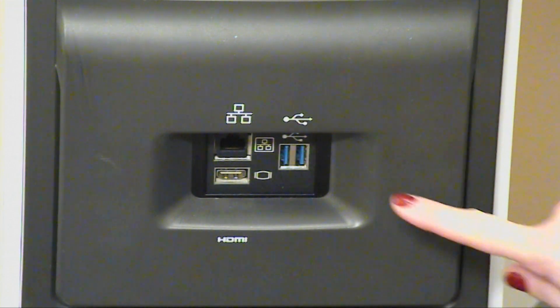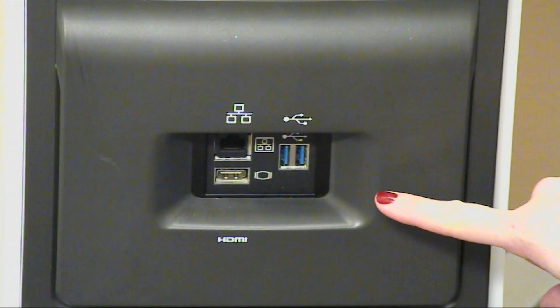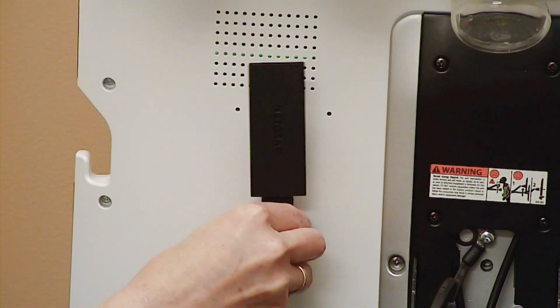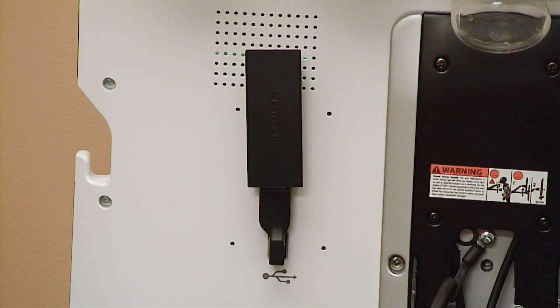On the back of the Venue, there is an Ethernet port, an HDMI port, and 2 USB ports. On the back of the Venue monitor is an additional USB port — if you have a wireless adapter, it can be placed here. Wireless is embedded on the VenueGo.